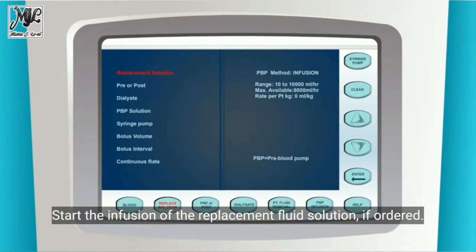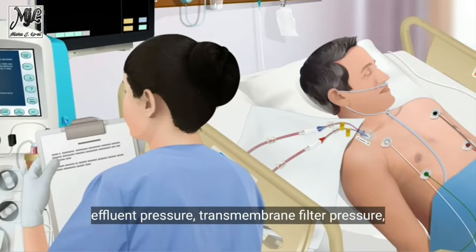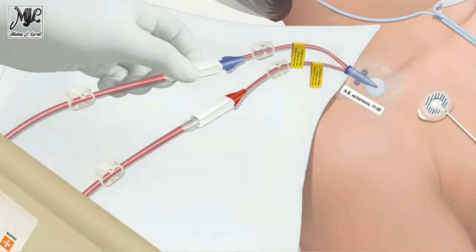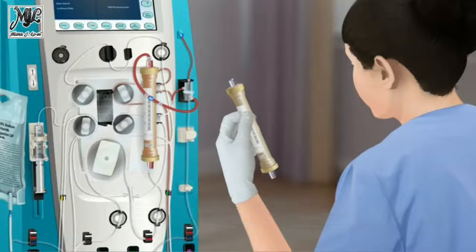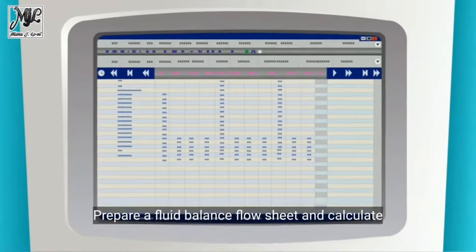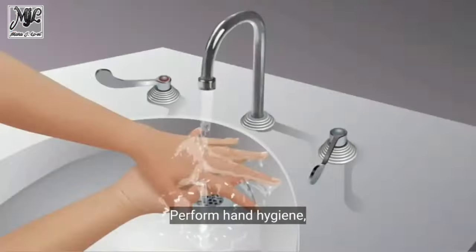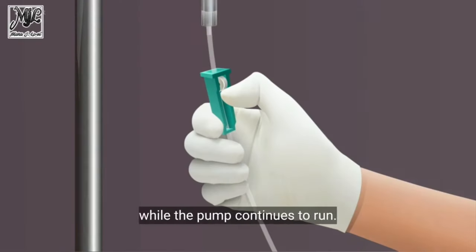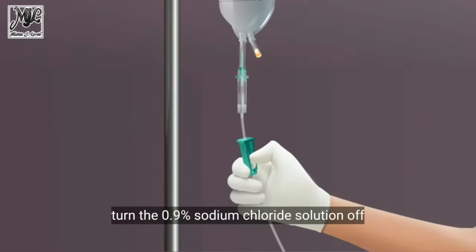CRRT is a slower type of dialysis that puts less stress on the heart. Instead of doing it over four hours, CRRT is done 24 hours a day to slowly and continuously clean out waste products and fluid from the patient. It requires special anticoagulation to keep the dialysis circuit from clotting.